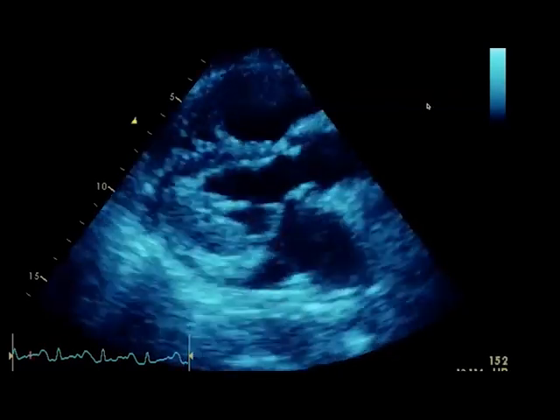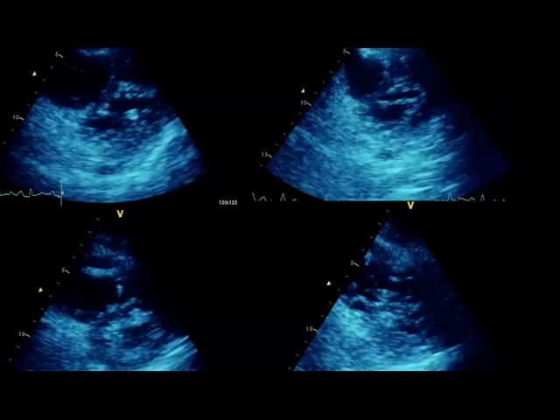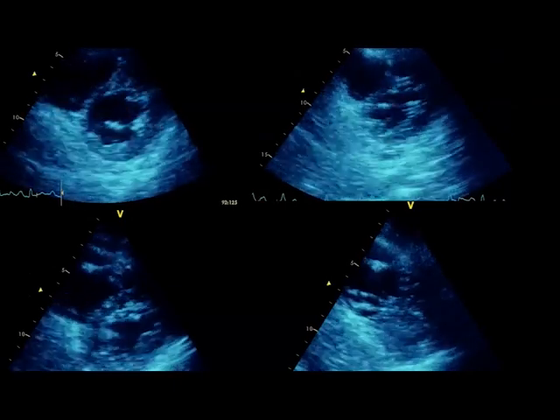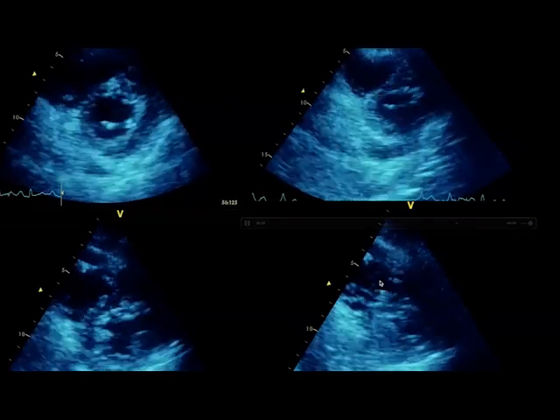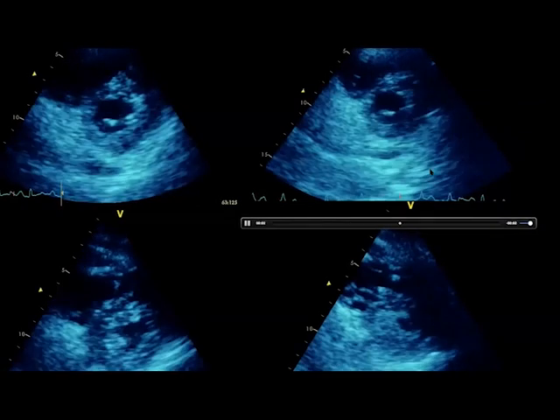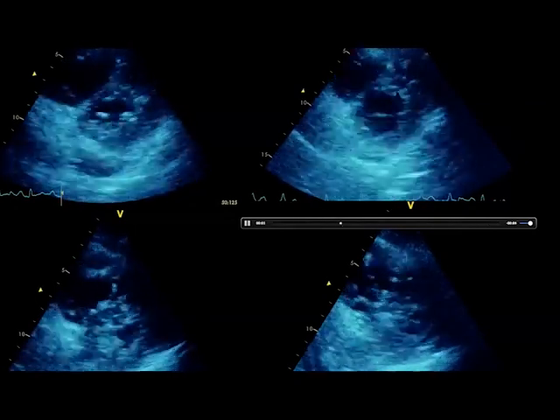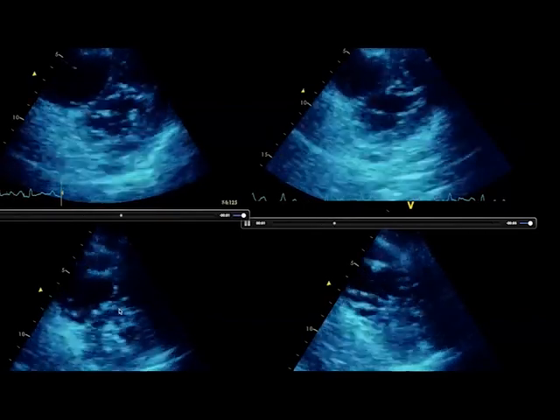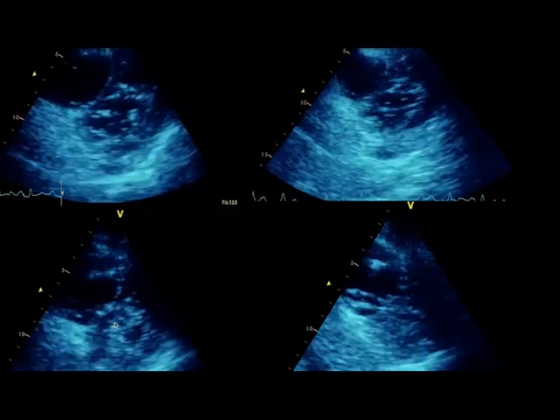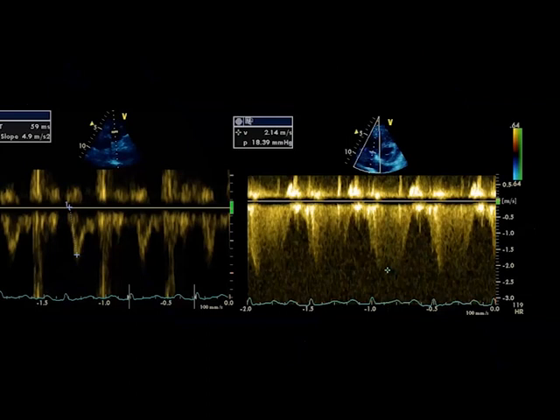If we have an abnormality in one plane we go and check others. The short axis is our go-to view for RV size and function. From the basal to mid-ventricular to apical views, with heavy trabeculation, we see a right ventricle that's twice the size of the left ventricle. The septum is pushed over to the left causing a D-shape, particularly during diastole, suggesting a fluid-overloaded state — and also signs of a chronically overloaded pattern.